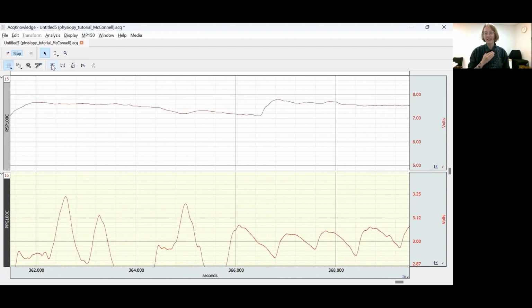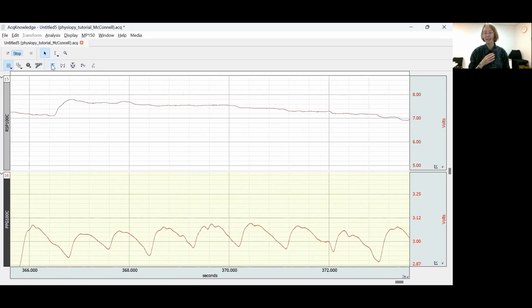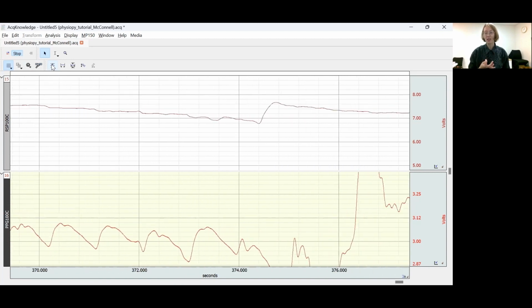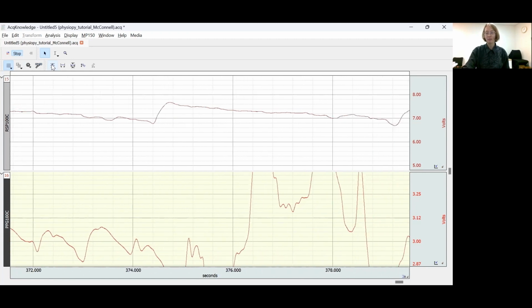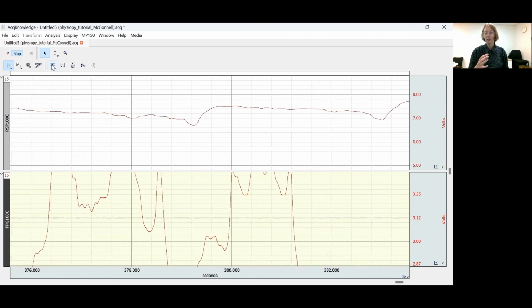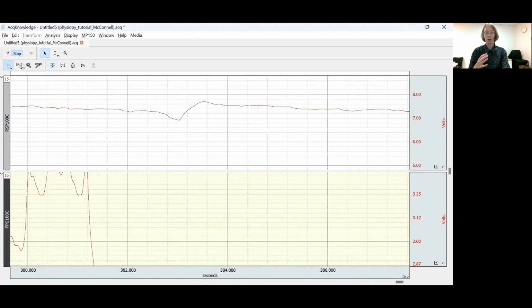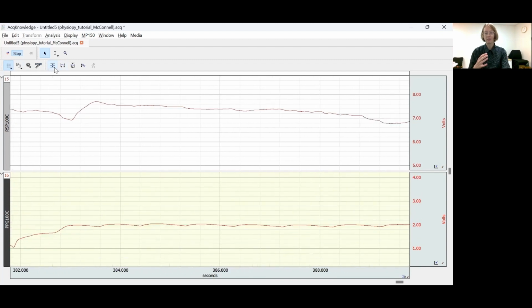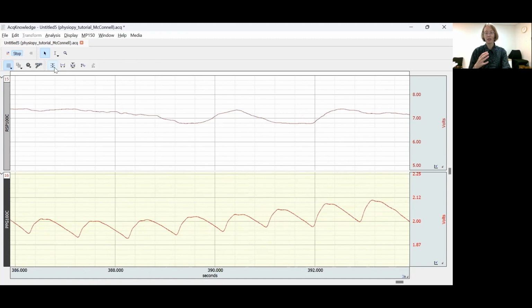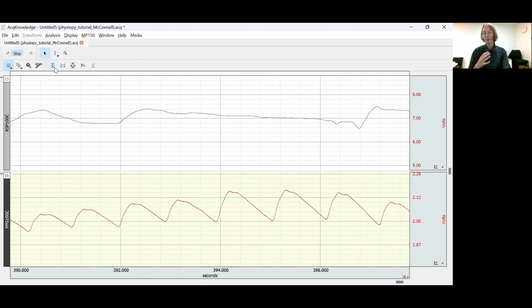This is a measurement that's going to be very sensitive to how your participant is moving in the scanner. And depending on how much the participant moves, the sensor can shift a little bit on the finger. So I've just moved this sensor. It should return to some kind of baseline we can read, but the shape will have changed. And in fact, it looks like it's no longer in quite as nice contact with my skin. The amplitude is smaller.